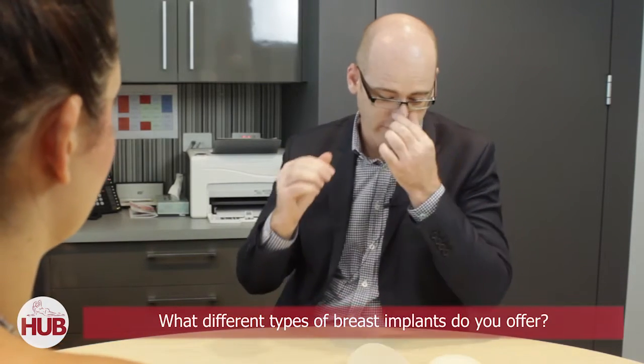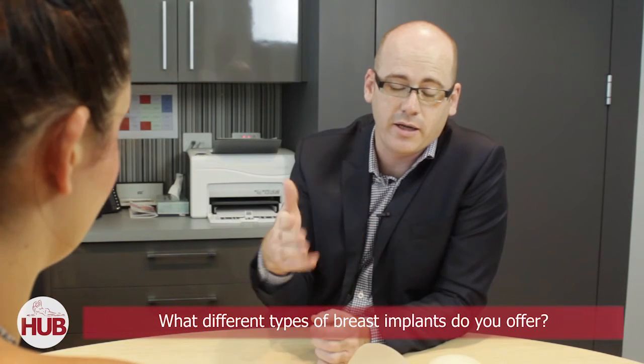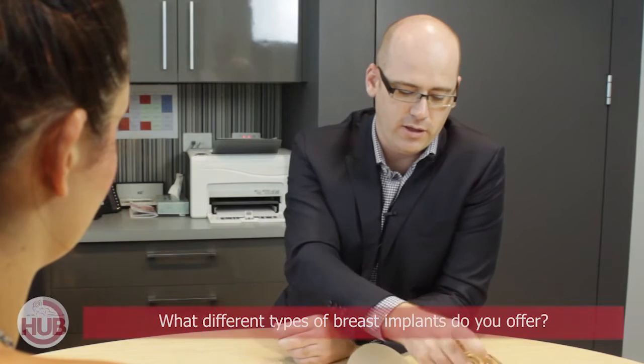So there's multiple different types of implants, and when we look at implants we break it down into sort of 5 or 6 different S's. So first thing we look at is the shape of the implant. The implants can typically be a round implant where the width and the height are the same, and then you can adjust the different projection of the implants, and that's how we adjust the volume.